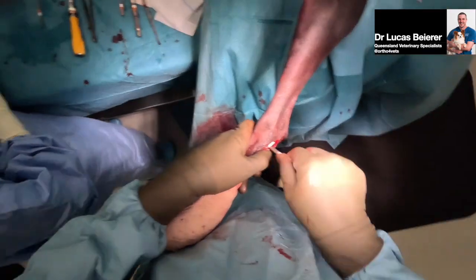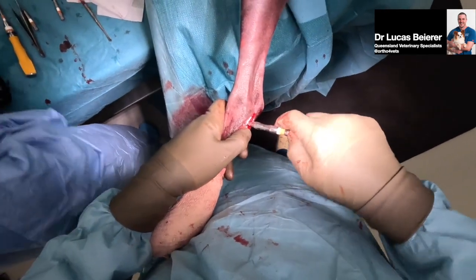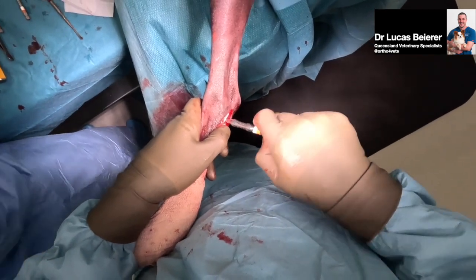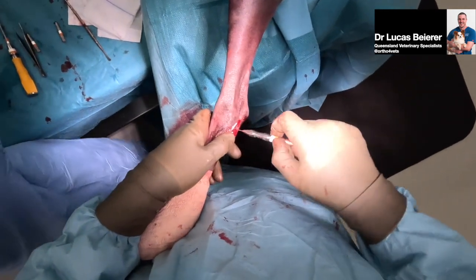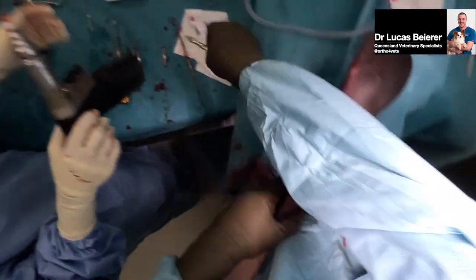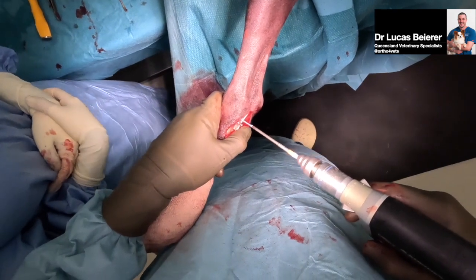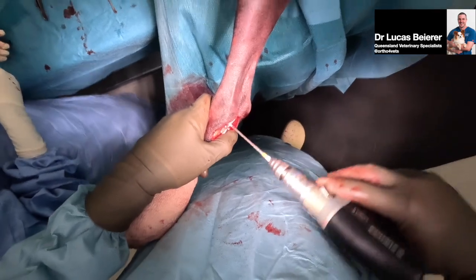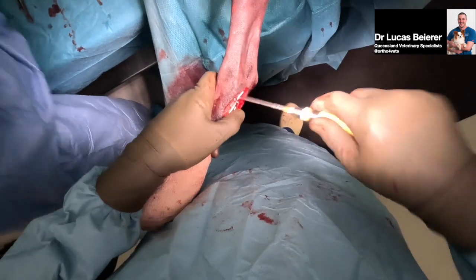Remembering that the area moment of inertia, AMI, of the implant is proportional to the size of its shaft, raised to the power of 4. So we get a lot of bang for our buck by going up a little bit. So 22, I think. Which sounds long, but I think we're in a bit of stuff there. Oh, we've got 2 screwdriver heads, great.